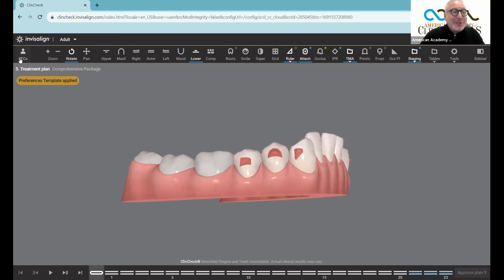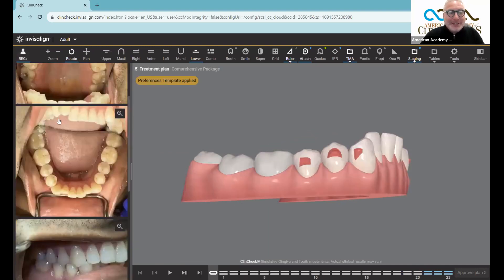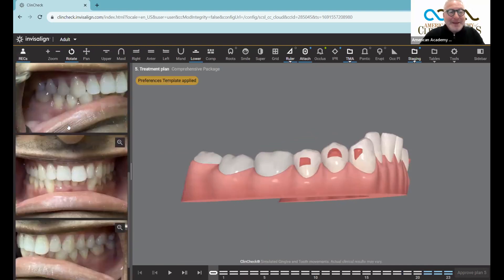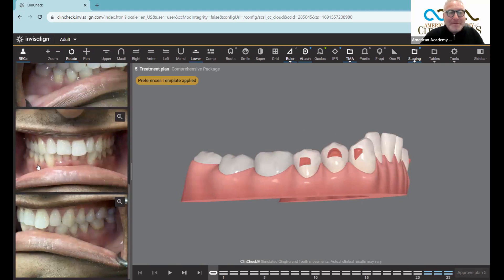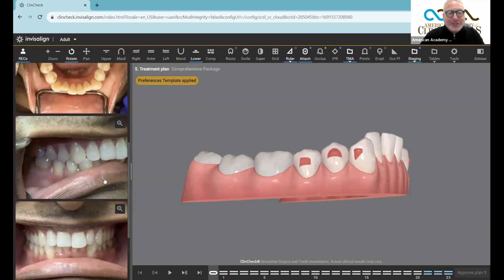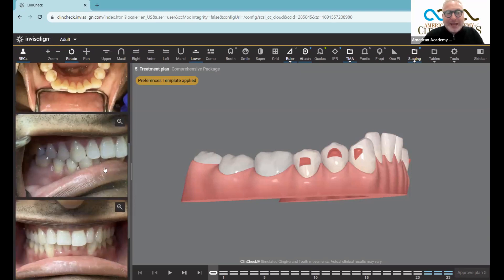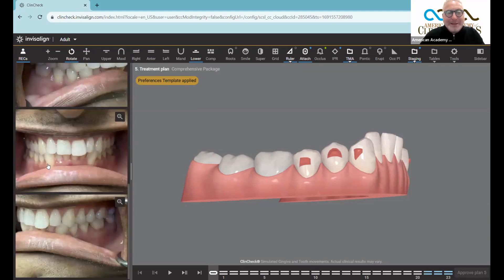The best way to do it is a clinical exam for the patient. Here, I didn't have the benefit of the clinical exam, but I'm going to look at these pictures. See this nice thick tissue here — I need a better picture just to be able to retract and see what this tissue looks like. But it looks like nice thick tissue here, and I think these teeth will successfully move.